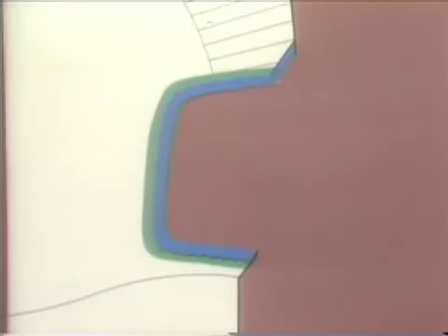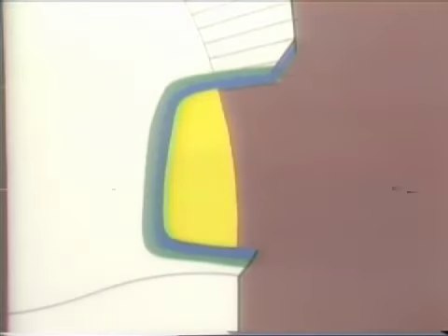The old amalgam and caries will be removed, and no attempt at internal retentive form will be made. Adhesion to beveled enamel and glass ionomer liner will provide the necessary retention. Dark yellow composite will be placed first to match the lost dentin and will be contoured more heavily at the cervical, as dentin is in the natural tooth structure. A layer of dark gray will then be placed and contoured to match the enamel of the natural tooth.